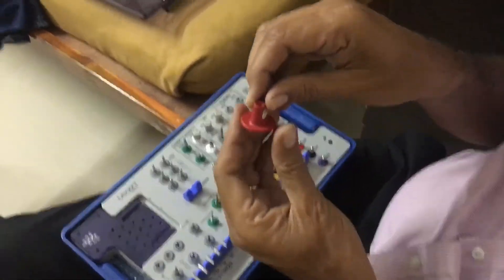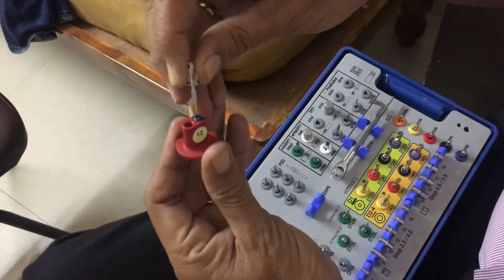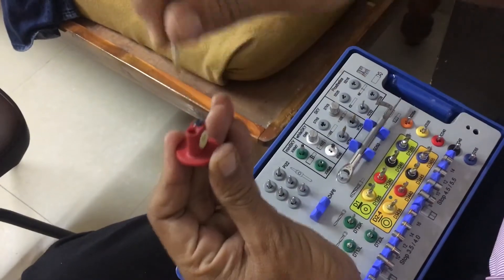You will find the implant in the vial like this. This is a mount — you will pick up and use the mount. I get a click here. Okay, I remove the implant.